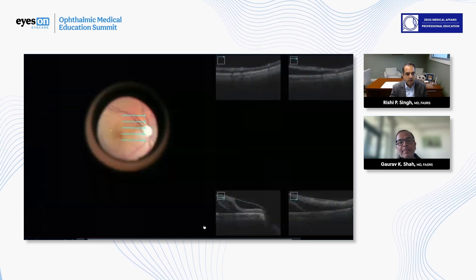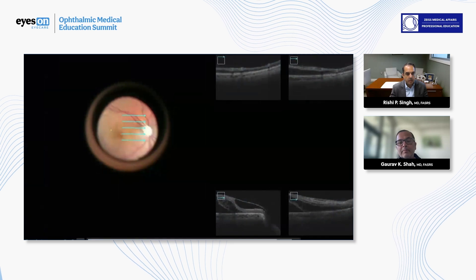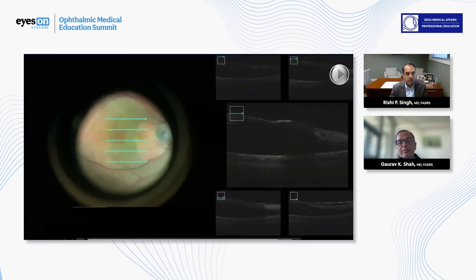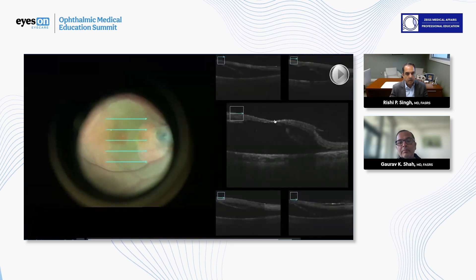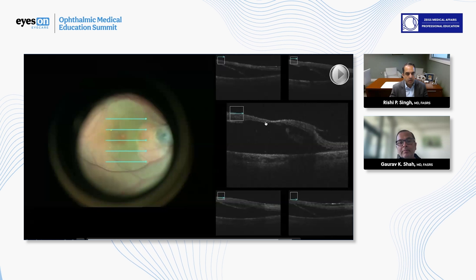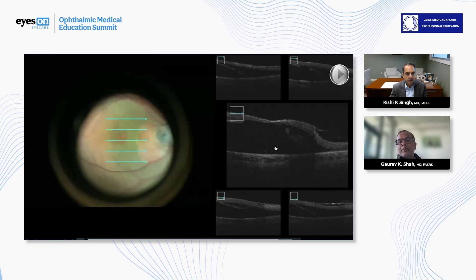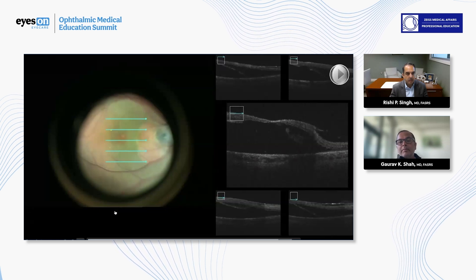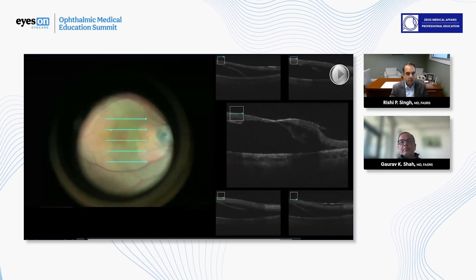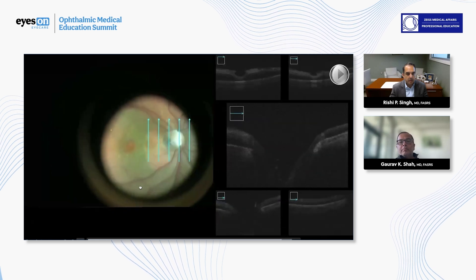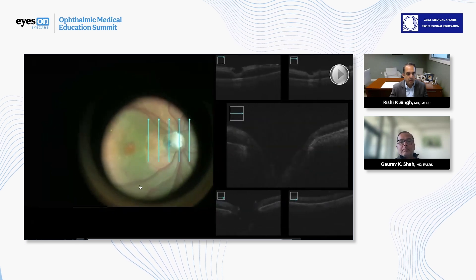Just watching the end of that video, you can see how thin the retina really is. That's got to be less than 25 to 40 microns of retinal thickness right there in dead center. Thankfully, we did not cause an inadvertent macular hole, which is always a kiss of death in these scenarios.